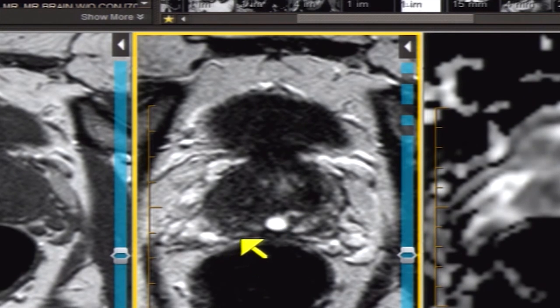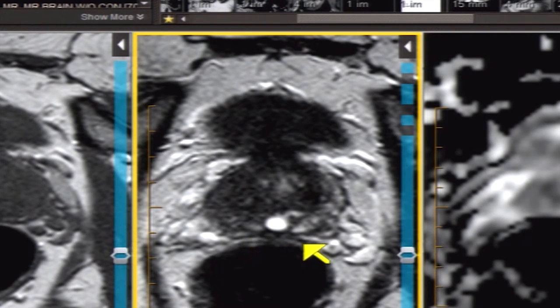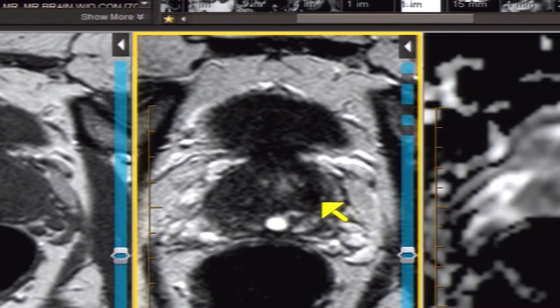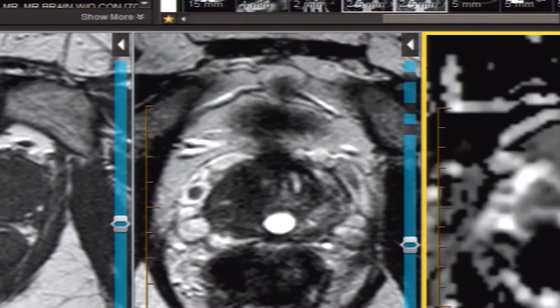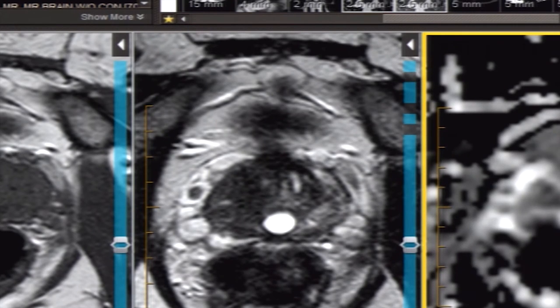Note that the bladder, which is urine-containing, has exaggerated trabeculation due to some prostatic hypertrophy. This very thin interface just anterior to the arrow is the Denonvillier's fascia, which separates the prostate from the rectum. On the right we have something called an ADC map, which is simply a map of the velocity of water molecules mapped out pixel by pixel.